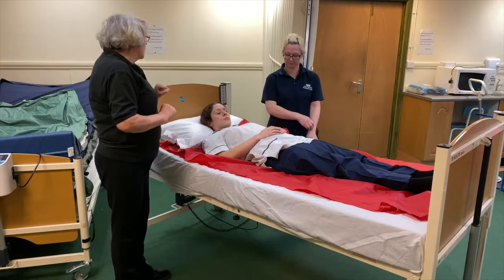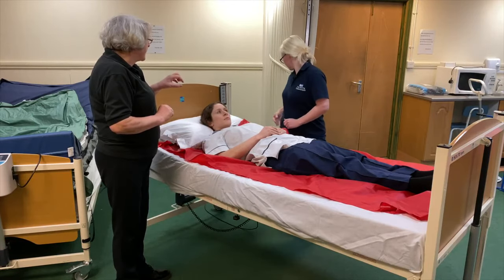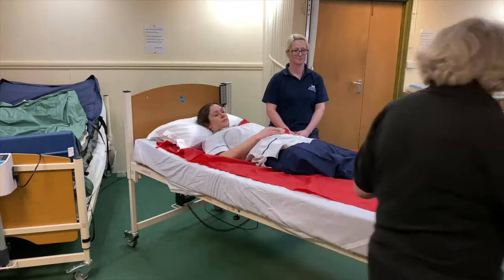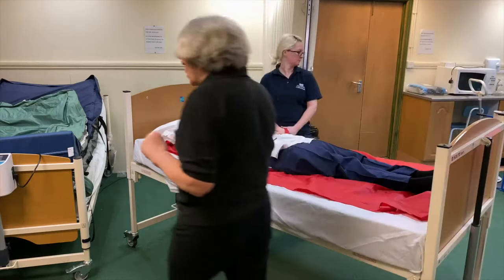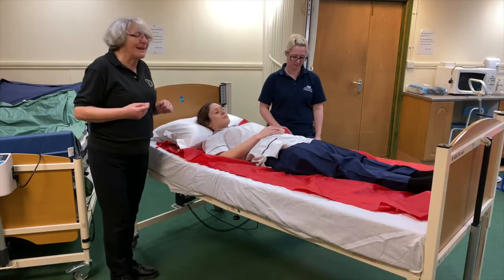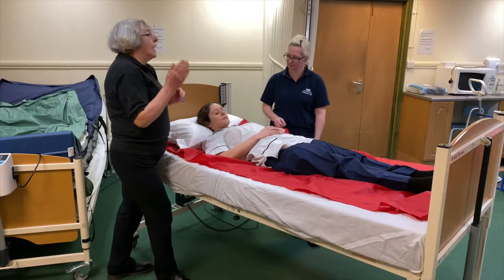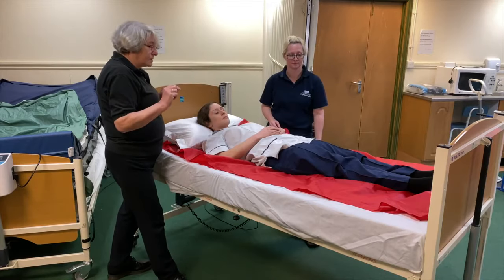If in the ward we haven't got enough space, and I'm just concerned you've got enough space there, Lisa, yes? If we haven't, then we take the brakes off the bed and we pull the bed out. We've got room at the top of the bed. Go back to your risk assessment. We are planning and we are preparing. So we come into our nice walking stance again. I'm looking down the opposite end of the bed and Lisa's looking down her side of the bed.